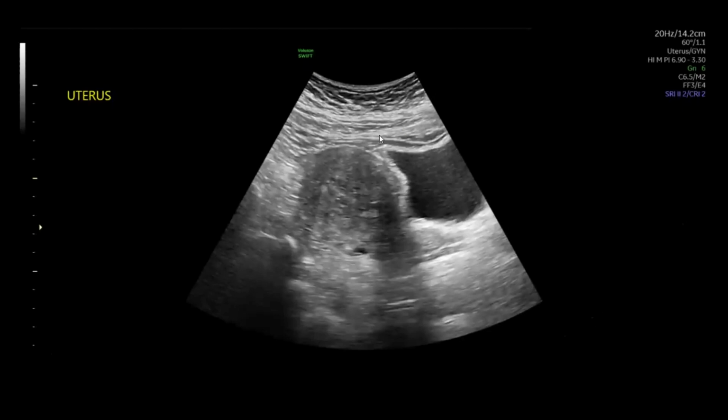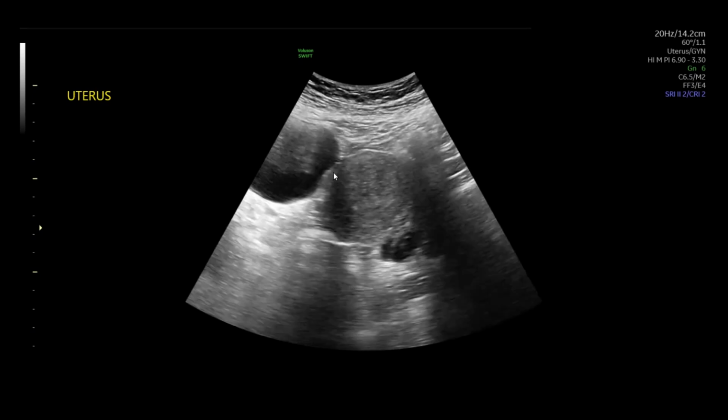And then we're just concluding the scan with a few transabdominal images, for the purpose, like I mentioned in episode 1, that we want to make sure we're not missing a large pathology. Sometimes we get more information out of a TA scan versus a TV scan. Interestingly, you actually can diagnose the adenomyosis pretty accurately on this one. You see there's a myometrial cyst, there's fan-shaped shadowing. It is giving a globular shaped uterus in this view, but we already know we don't think that's necessarily true, though it does have a bit more of a light bulb shape there.